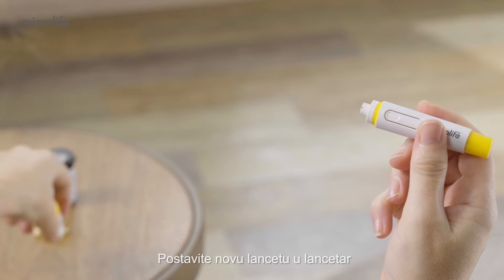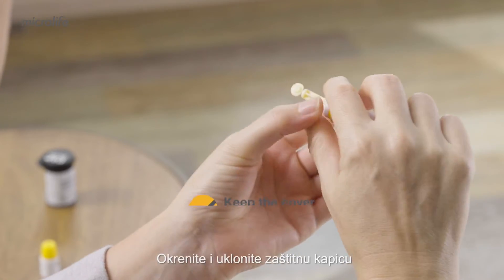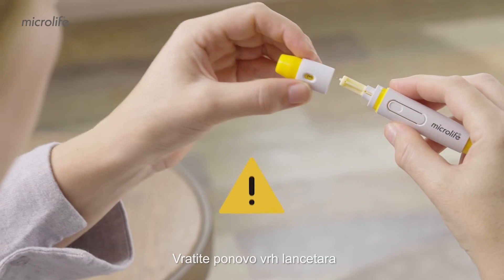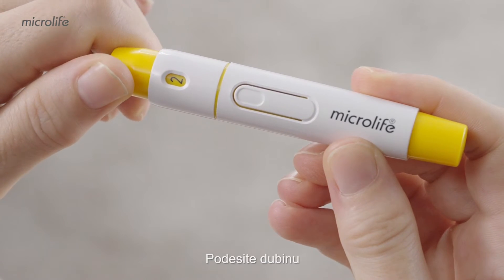Load a new lancet into the lancing device. Twist and remove the protective cover. Place the cap back on the lancing device. Adjust the depth.